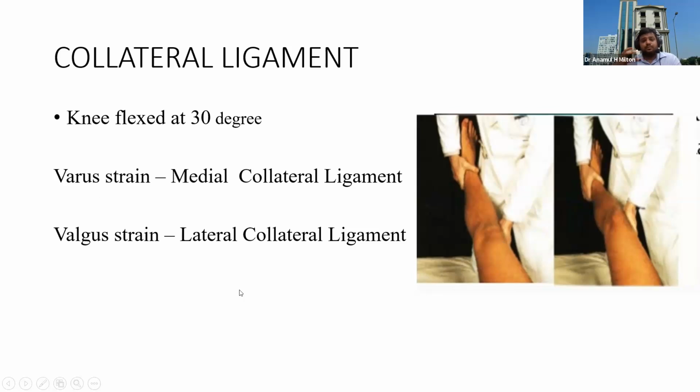So at that time, if it provokes the same pain or more pain when stressing these things, you should consider whether there is any collateral ligament problem, either some fiber tear, or some degeneration, or some tear or not.